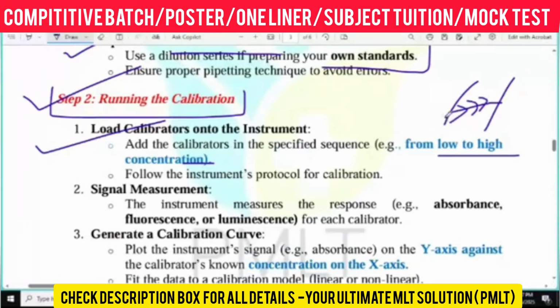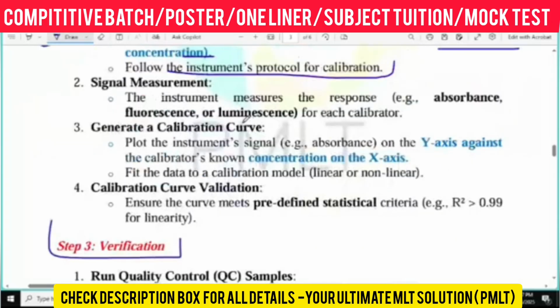Getting my point? But if only one is required, then you use that one calibrator to load the instrument properly, and maintain the protocol of this particular instrument properly.